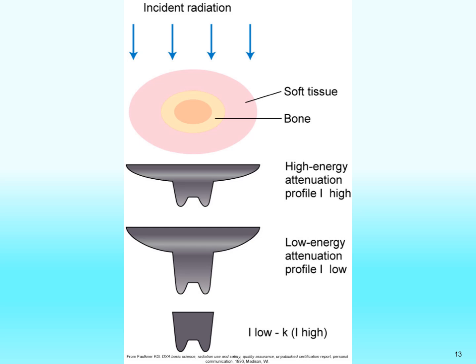And so when subtracting these two things, the soft tissue is mostly going to be the same attenuation from high energy to low energy, but the bone tissue is going to show a radical change in attenuation between low and high energy. So we can isolate the bone tissue by subtracting them away.